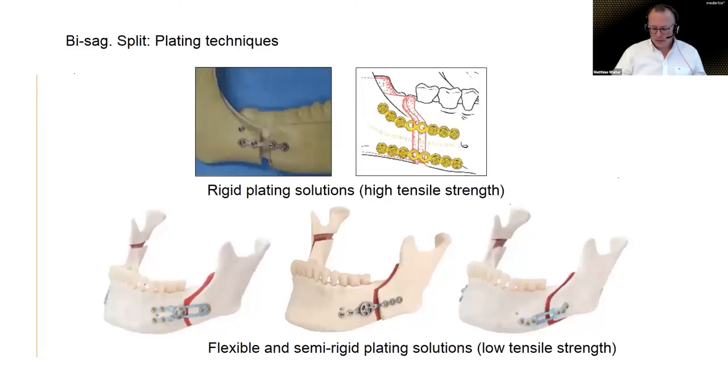Good, just to continue, so I don't want to use up too much of your time, obviously. A little excursion towards what means now orientation of a plate, so flat side and upright side. So in a mandible, maybe some of you are max surgeons, I don't know. But just in a mandible, you have once in a while the situation that you have a patient with a mandible that is too short, you have a retrognathia of the mandible, so therefore you have to transport the mandible forward in order to get a proper occlusion of the maxilla and the mandible. So therefore you have to somehow sort of separate the body of your mandible from the what's called the ascending branches and to mobilize then therefore the body.